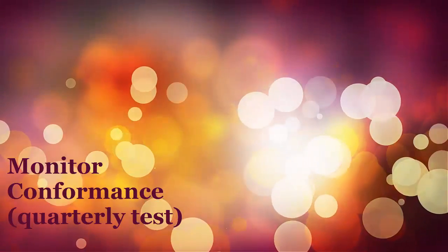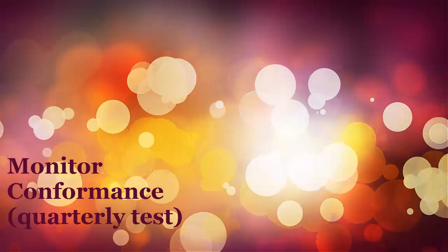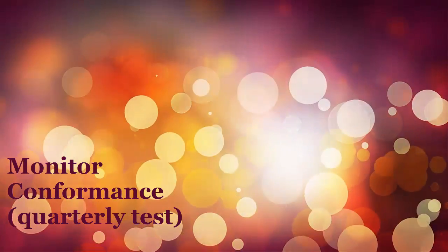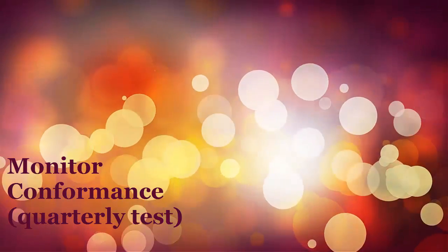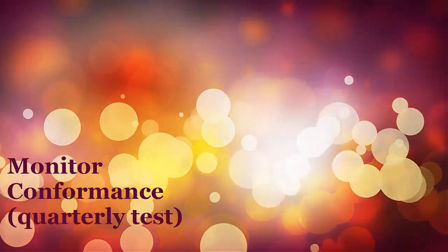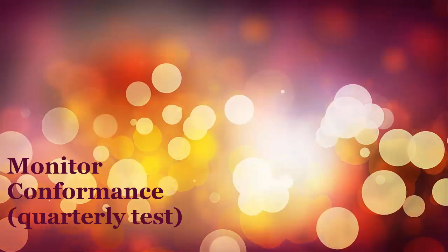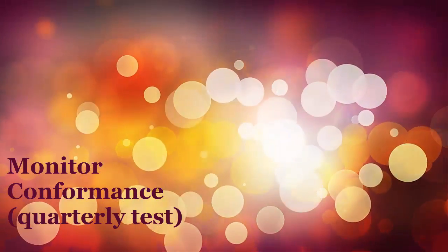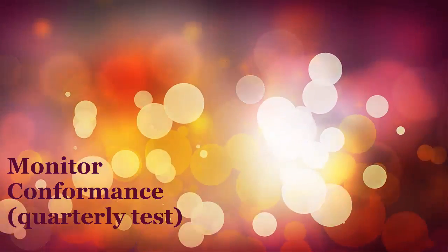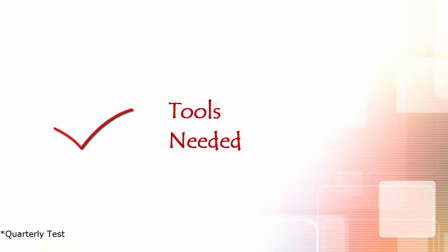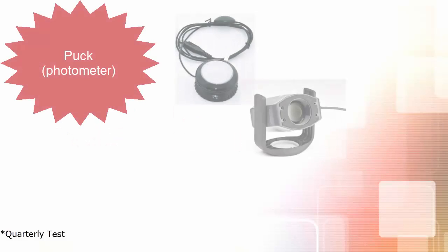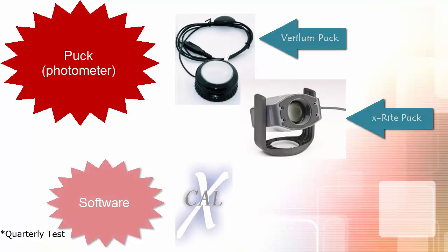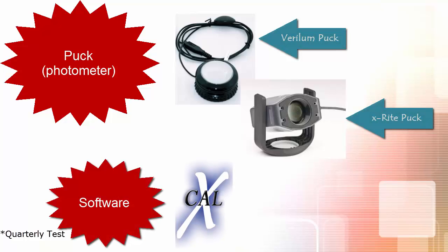Welcome to this video tutorial on how to perform the Quarterly Monitor Conformance Test. To accomplish a quarterly conformance test, please ensure you have the puck and the XCal software.